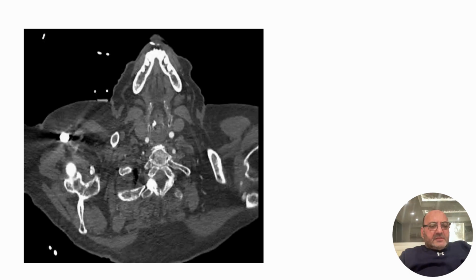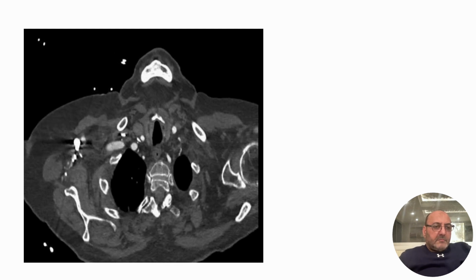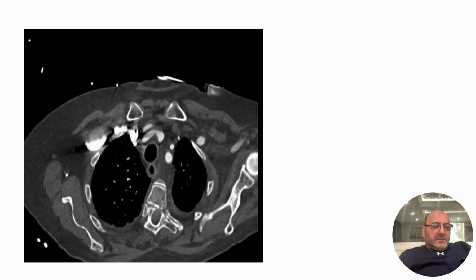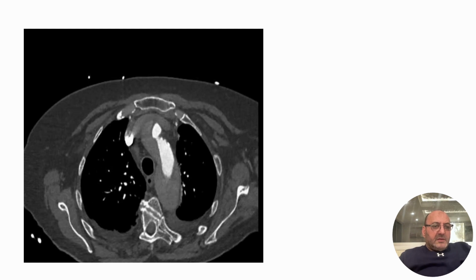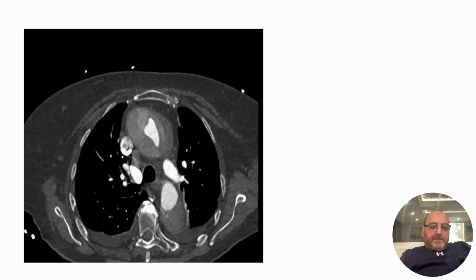And this is another case where I wanted to show how important that distance between the innominate and the coronary arteries is, basically. This is somebody who had pseudoaneurysms, came in with severe mediastinal hematoma and rupture in the ascending aorta, and you see the hematoma is pretty big, pretty large.